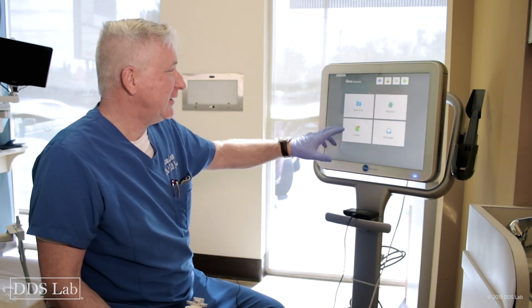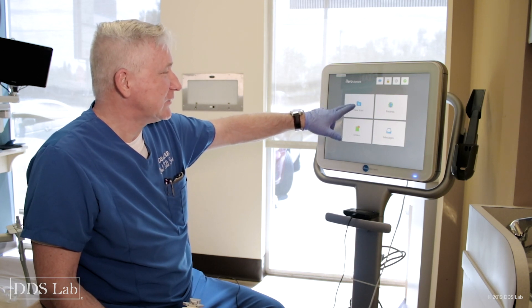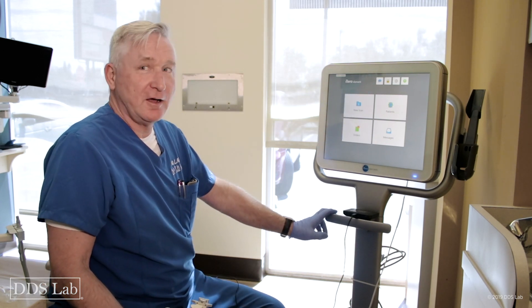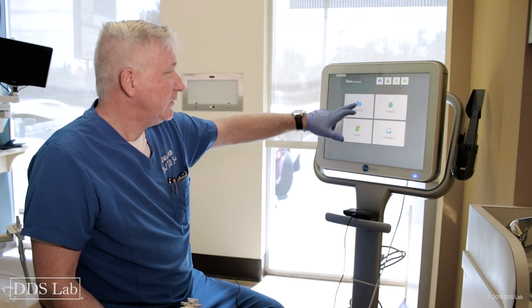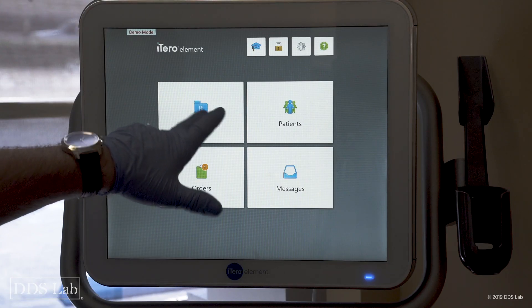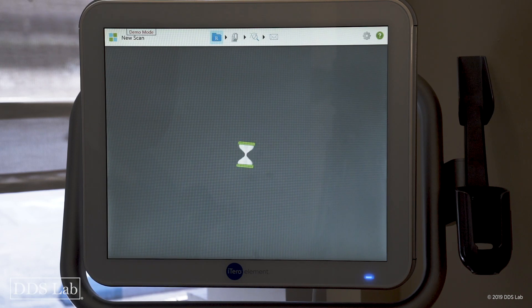Today I want to show you the Element iTero scanner and I want to scan a crown. I'm going to demonstrate the efficiency of that scan. First I'm going to go into new scan.